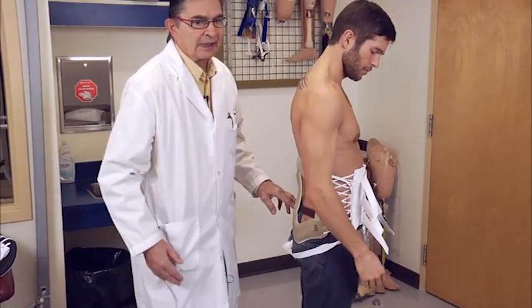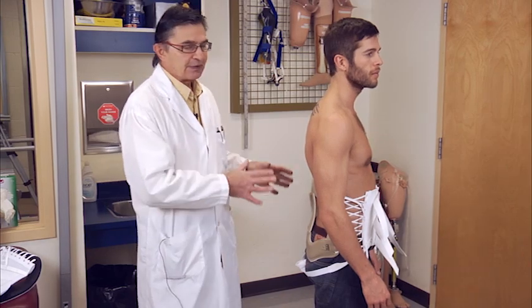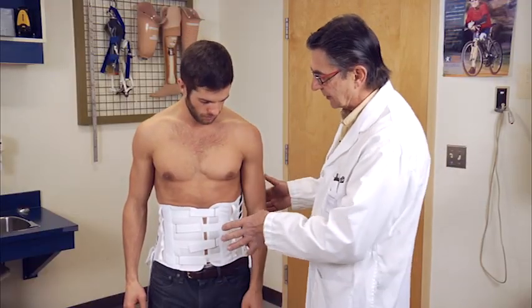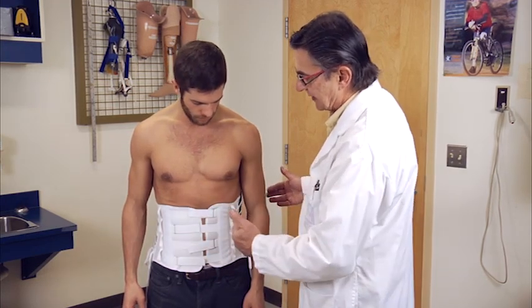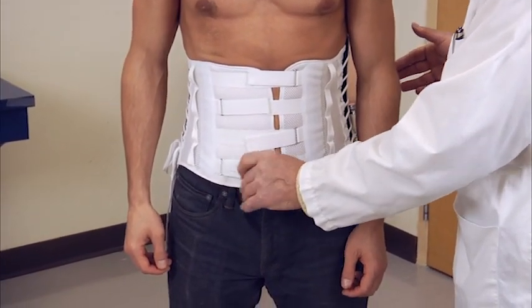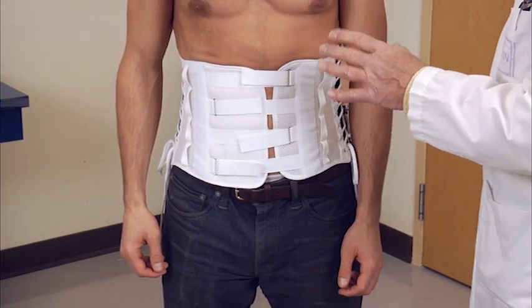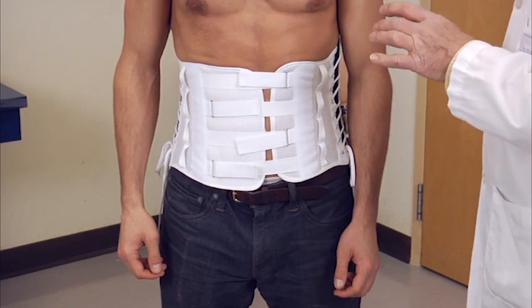Regardless of the type of brace you get, whether the Velcro closure or the hook closure, the structure is always the same. Here we have the Velcro closure chair back brace. The structure of the braces is the same and it has a corset front. The only difference is that these have Velcro closures. Sometimes patients will feel more comfortable with a Velcro closure than with the buckles. The buckles are stronger; the Velcro is easier.